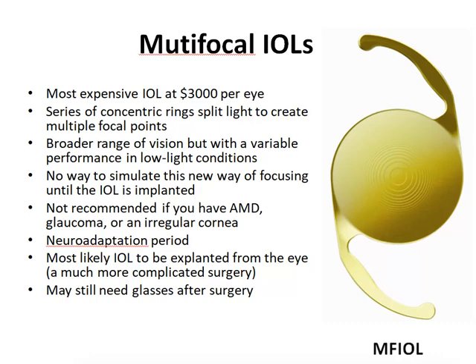The way that they work is by splitting light to provide different focal points. As a result, they work best in situations where there is plenty of ambient light.